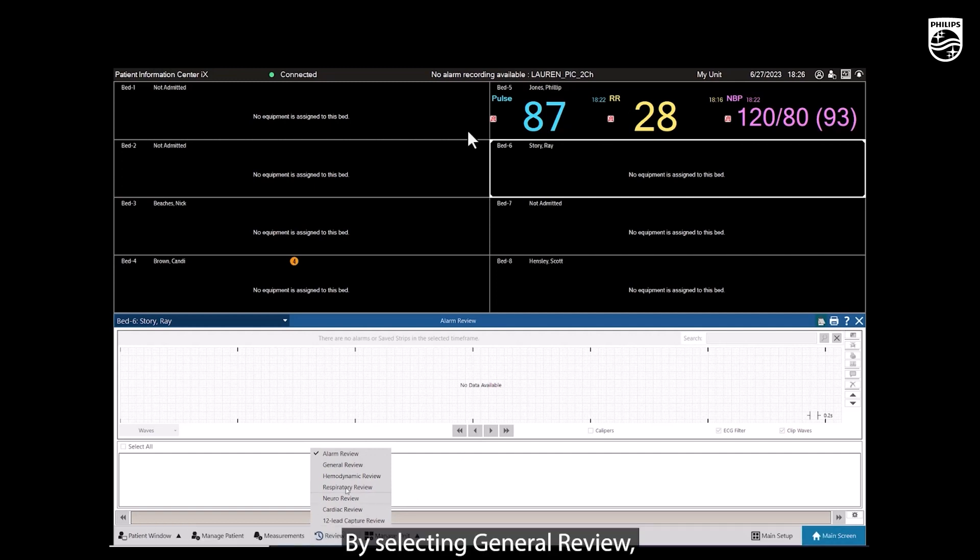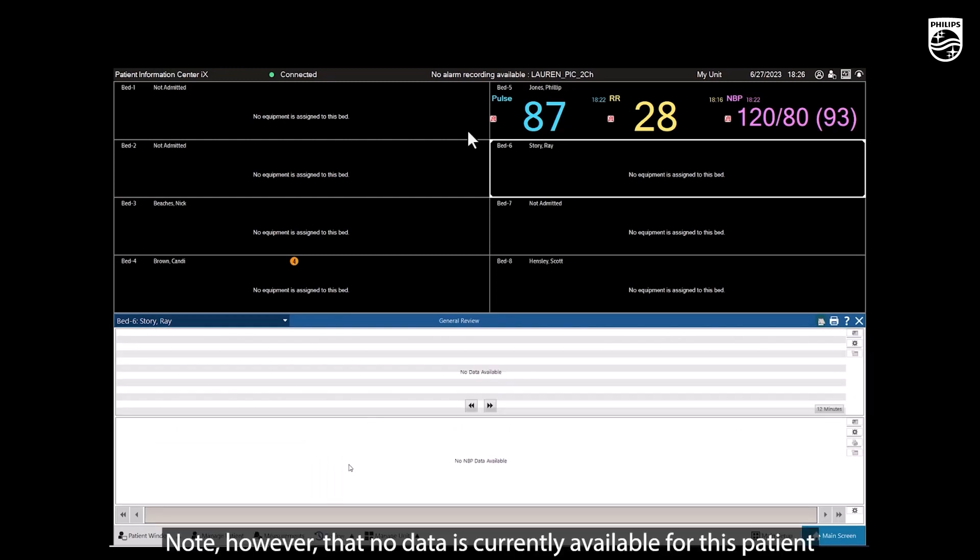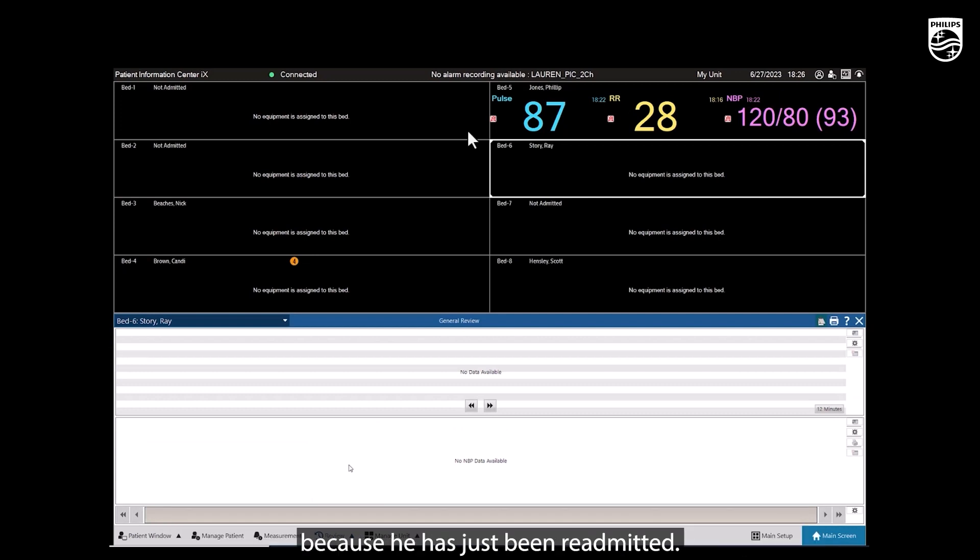By selecting General Review, we can display a record of all vital signs that have been saved for this patient. Note, however, that no data is currently available for this patient because he has just been readmitted.